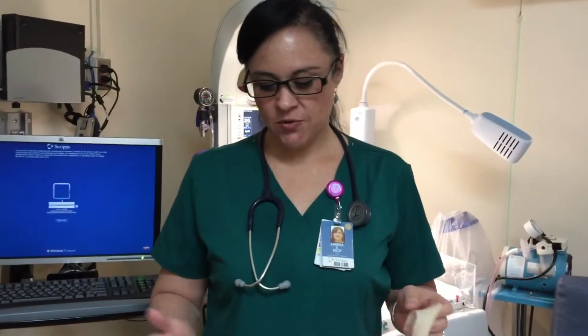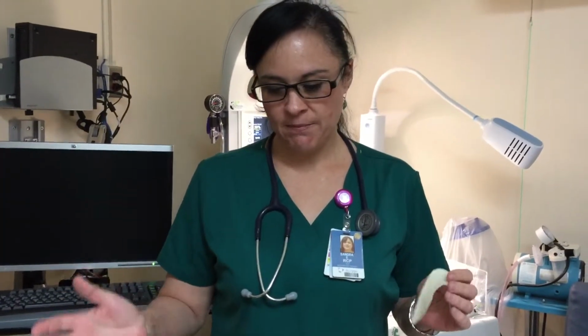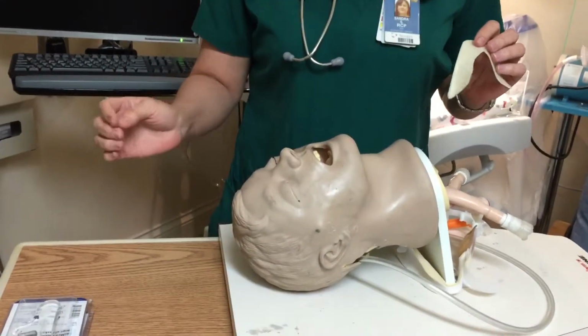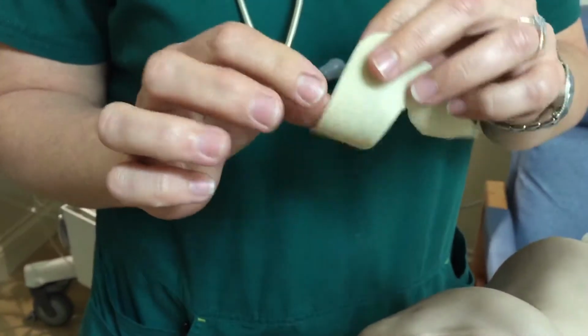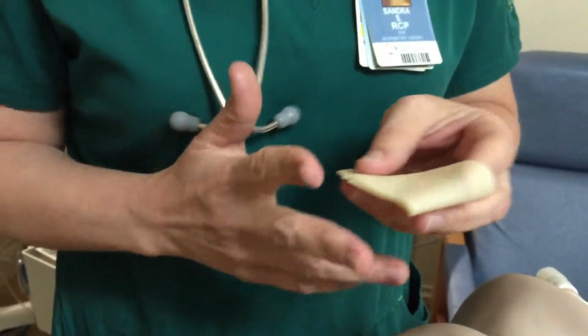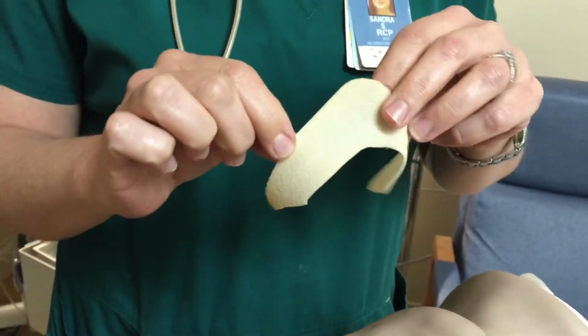Okay, so we've already inspected the skin and we're ready to choose the skin barrier. So the first, if there's no redness to the skin, if all the skin is blanchable, the first step is to use Mepilex. So this is the Mepilex Light. It comes in a little square box. You fold it, you cut it, and it becomes a triangle.